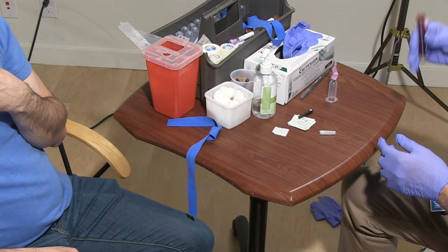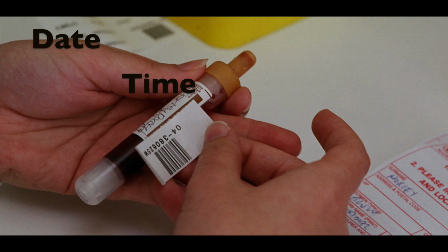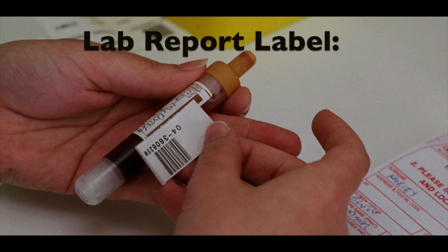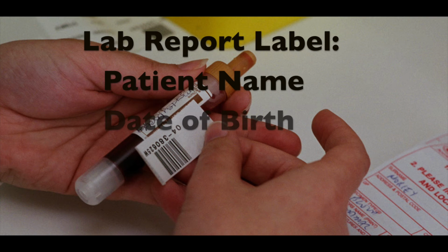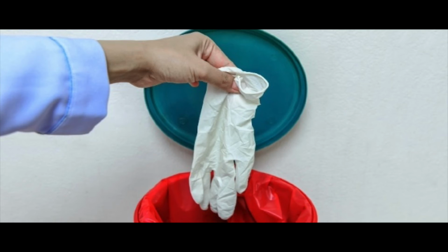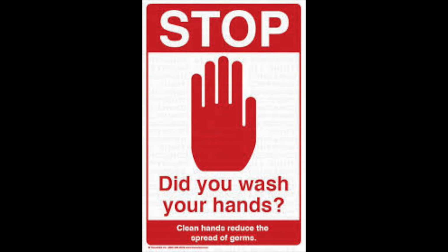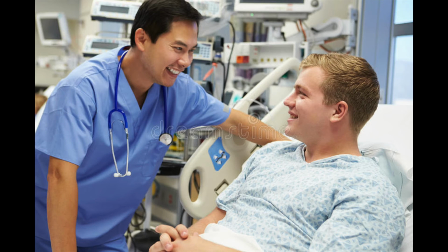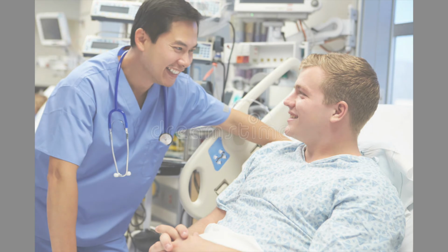The sample tubes are labeled with the date, time, the phlebotomist's initials, and a lab report label that contains patient name and date of birth and lab requisition serial number. The tubes are placed in a plastic Ziploc bag. The medical assistant removes and disposes of his or her gloves appropriately and washes or sanitizes his or her hands before returning to patient care duties with this or another patient.